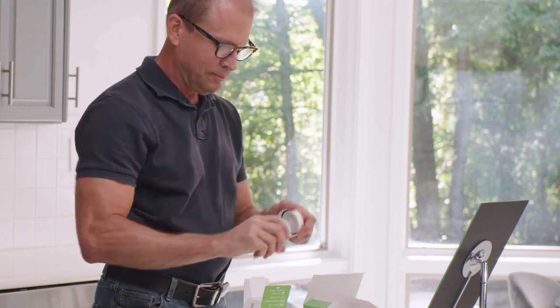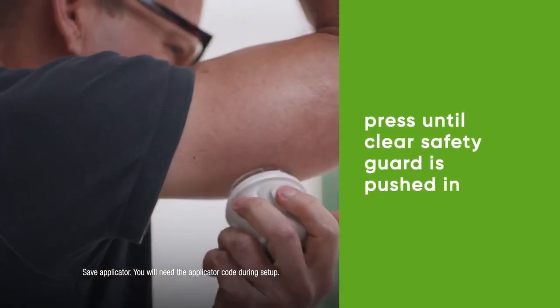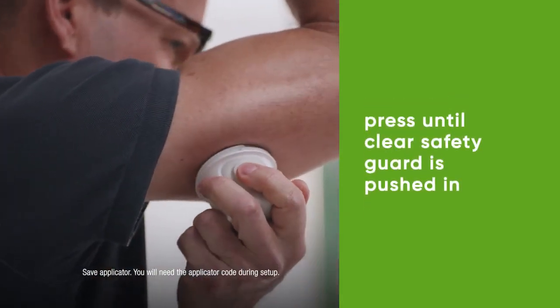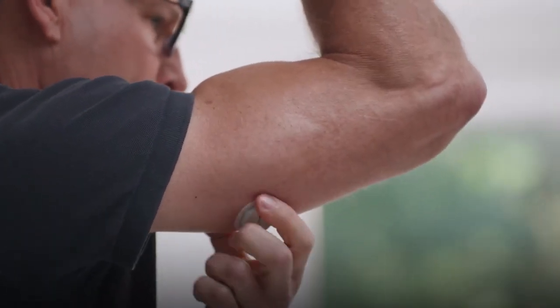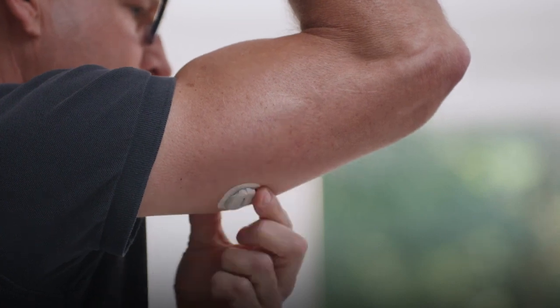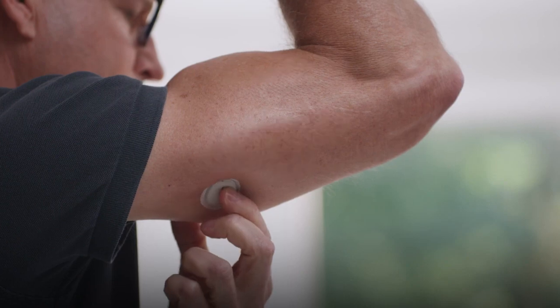Grab your applicator and unscrew the cap. Don't touch inside the applicator. Press and hold the applicator firmly against your skin. Now push the button and remove the applicator. To help keep the patch on your skin, rub firmly around the patch three times.